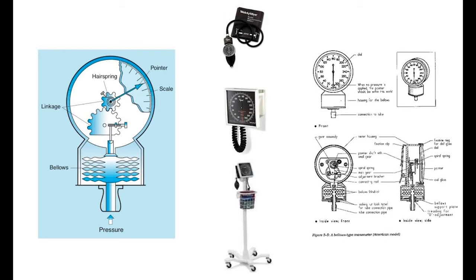If you think just about the wear and tear on a daily basis, the wall cuff may get a fair amount of usage, but it only rocks back and forth a little bit. But if you whack it a few times, the moment you tap the dang thing, it's out of calibration. The ones that we wander around with room to room, they're even more susceptible to miscalibration because of wear and tear and use. And you got very sensitive set screws in there, and there are at least two of them that are important, one that zeros and one that translates the magnitude of the pressure change to a magnitude of a needle change. Every time you whack the thing, drop it, every time the patient accidentally nails it with their elbow, it loses a little bit of calibration.